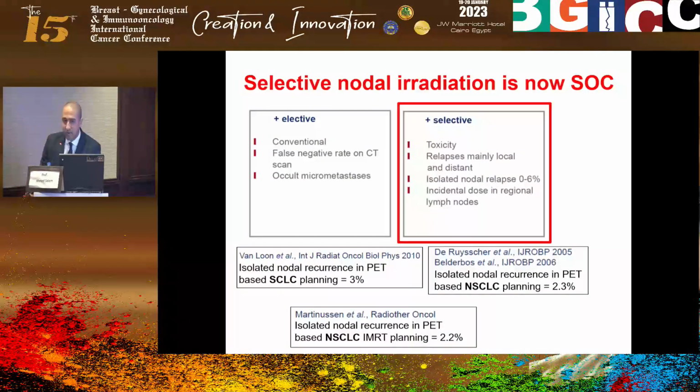Do you have experience using abdominal compression? I'm establishing my program. I will start the SBRT program of the lung by the beginning of next June. I read a lot, so I found this maneuver because sometimes the lung patients have a problem: the tumor is on top of COPD, on top of lung problem, so the wave of the respiration itself is sometimes very high, exceeding sometimes 1 centimeter.